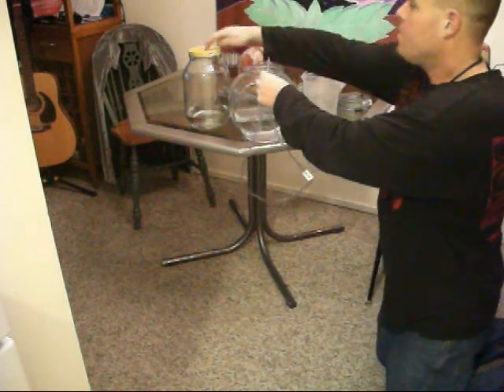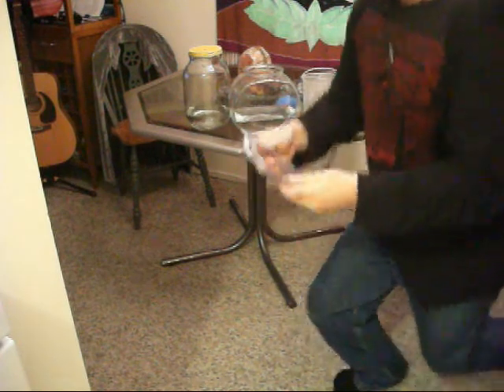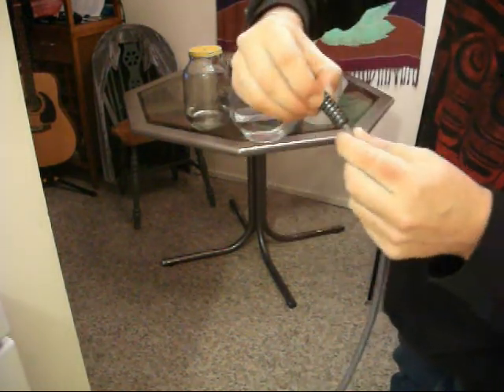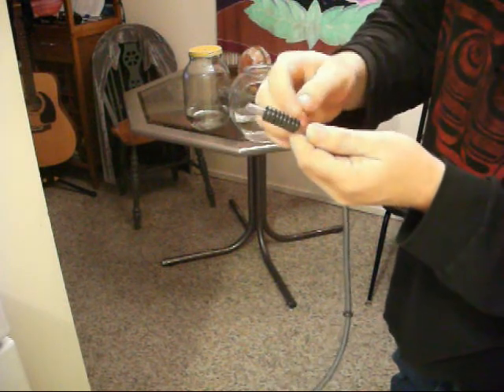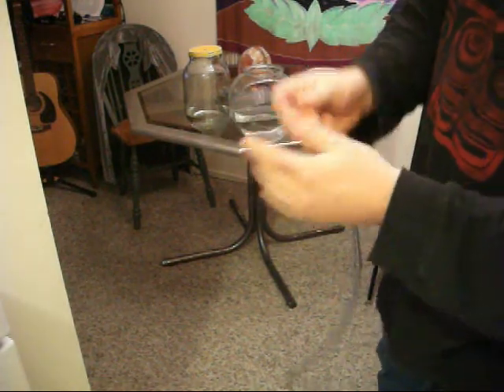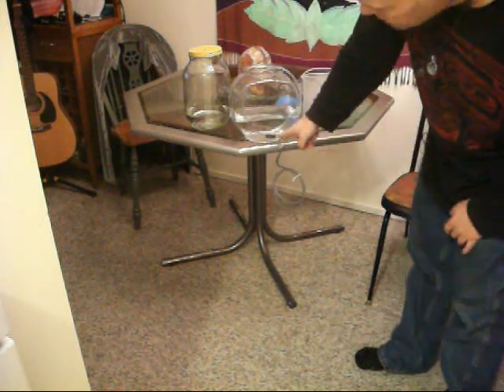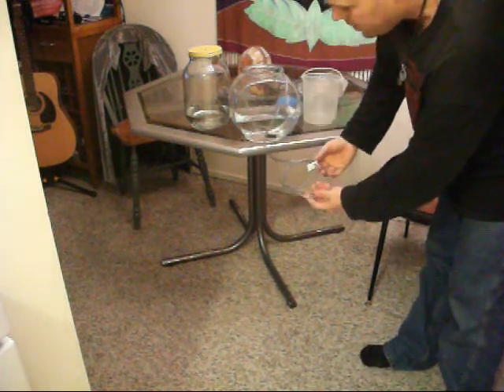But what I found, either use the lid, or if you're not using the lid, what you want to do is use hematite, from these necklaces. This is a kind of gemstone. It's slightly magnetic as well, and it's a grounding stone. It's the root chakra. So I use that as a weight. If I stick it in there, and then I put one more up here so it just catches on the edge, it's right at the bottom. Therefore all the water will go down, and you use it just like a regular enema.